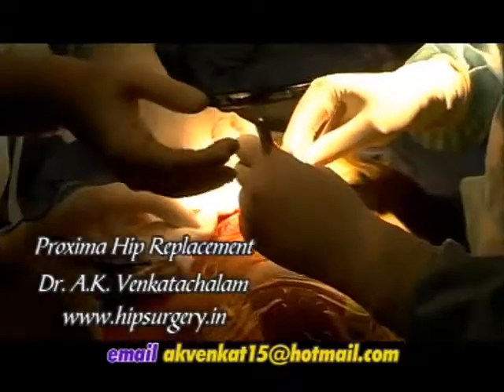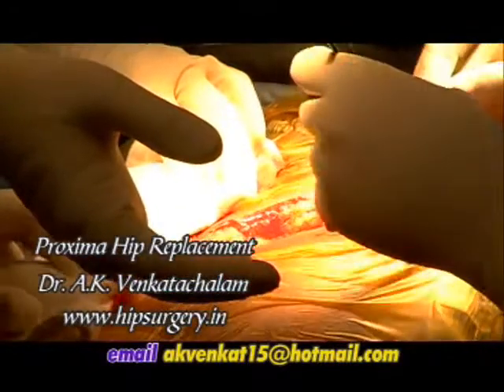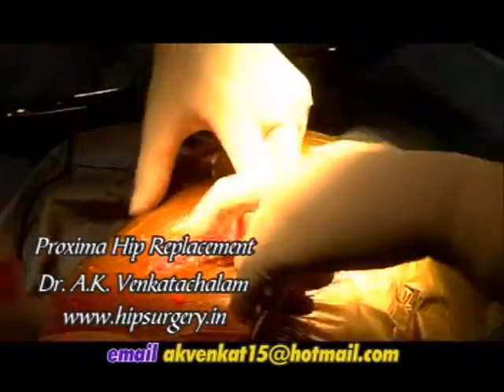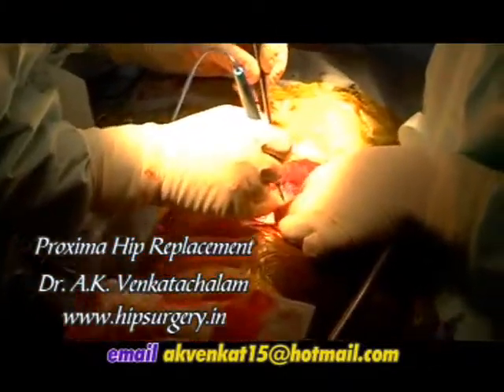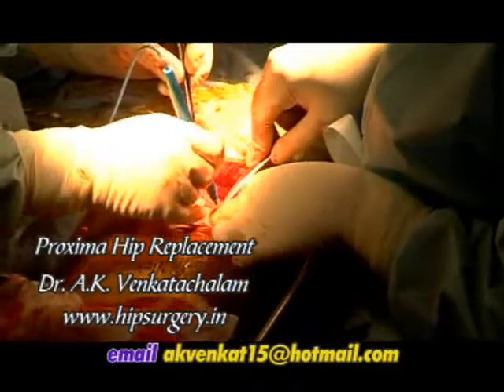With the patient in the lateral position, the hip is exposed through a posterior approach. To provide optimal visualization of the rim of the acetabulum, the femoral neck and the proximal femur, the Proxima hip round-the-corner technique for femoral preparation is ideally suited to minimally invasive surgery.